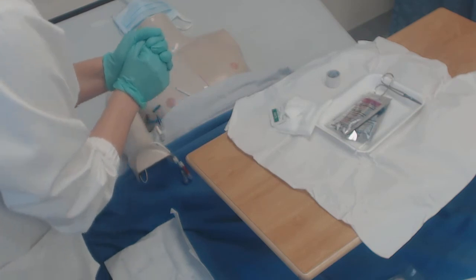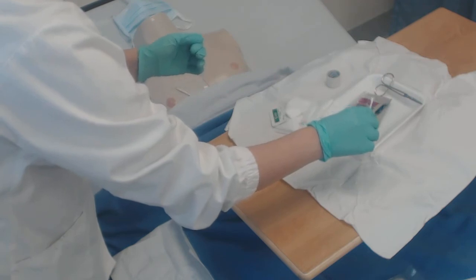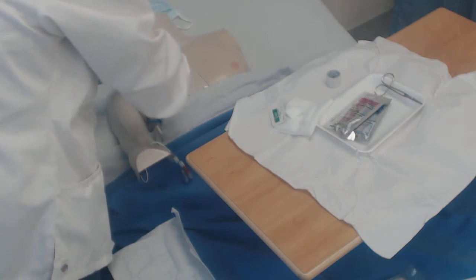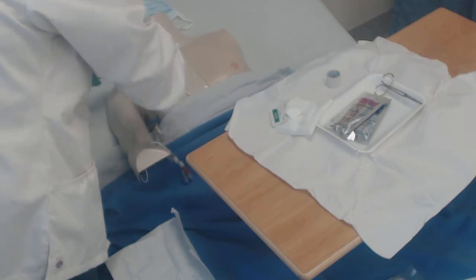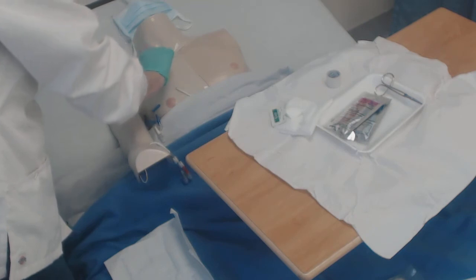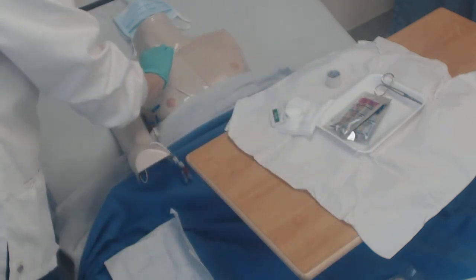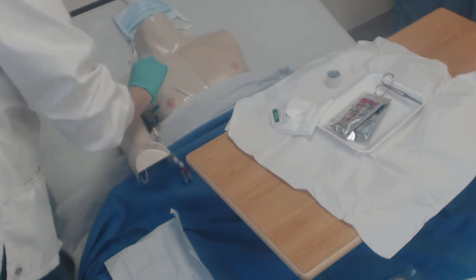Now I'm going to take my swabs — there are three of them. I'm going to swab from the inside out and throw it away, get another one from the inside out and throw it away, then the third one from the inside out and throw it away.